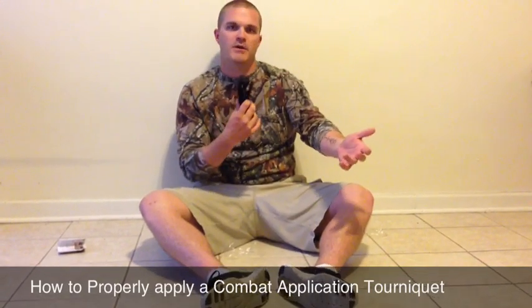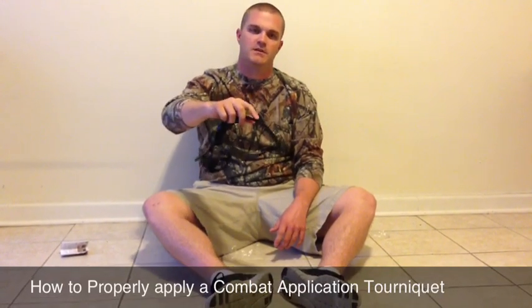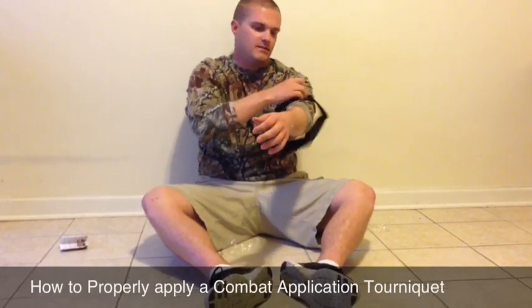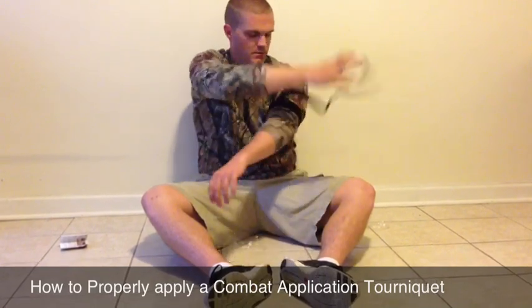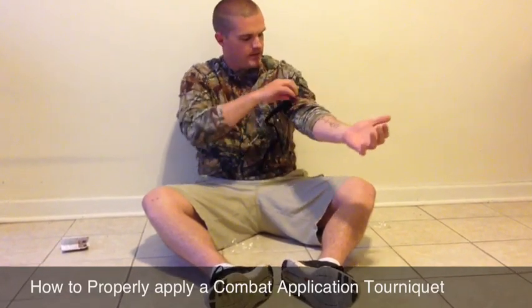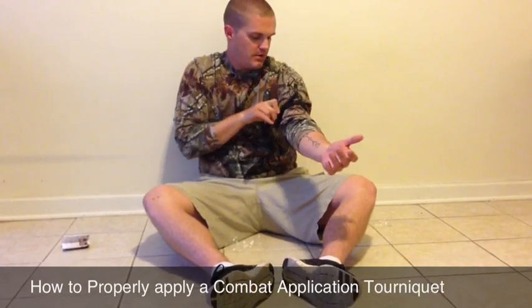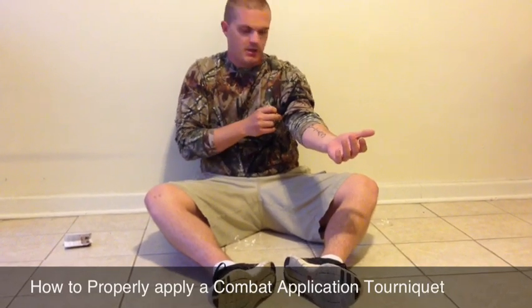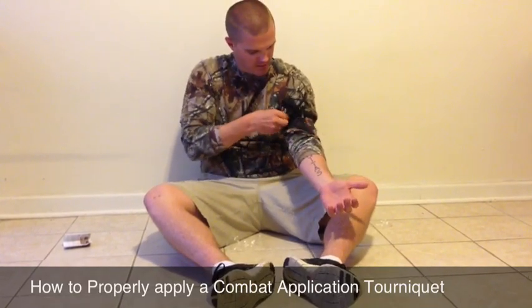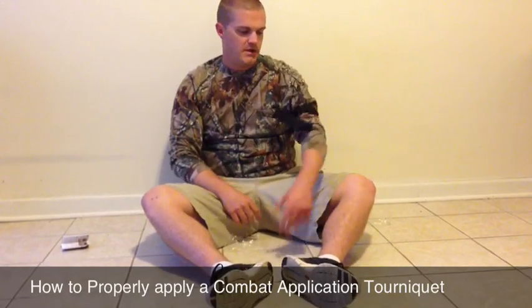Say if I have an injury on my left arm, I can pull this out — whip it out like that. You want to try to get the tongue to go towards the outside of your body. Put your arm in. You want to put all tourniquets at least 2 inches above the wound. Pull it tight. This here is called the windlass — twist it until all the bright red bleeding stops. That's an artery. It will then lock into place. Put this part over it, and here is the windlass securing strap. Now you should have stopped bleeding.